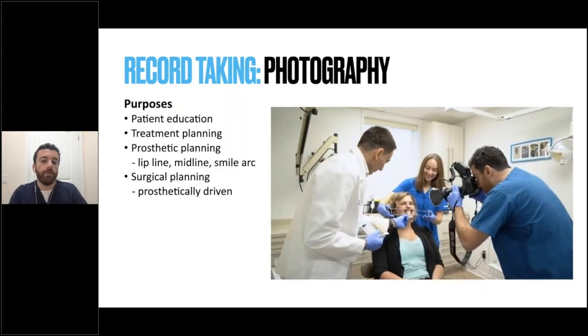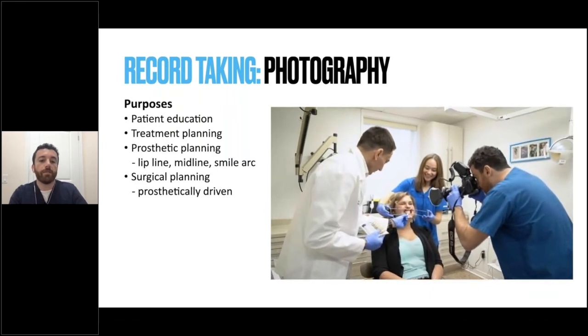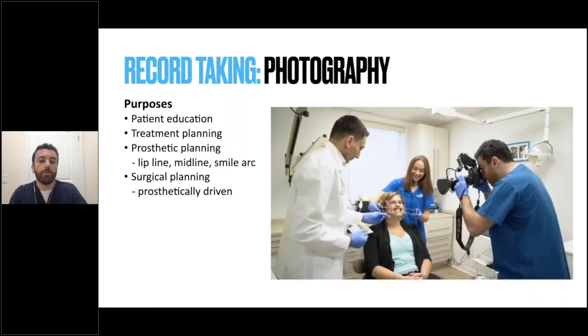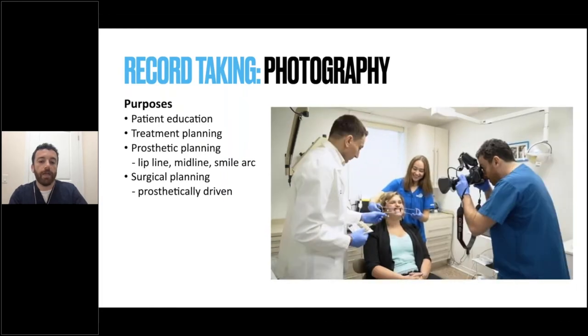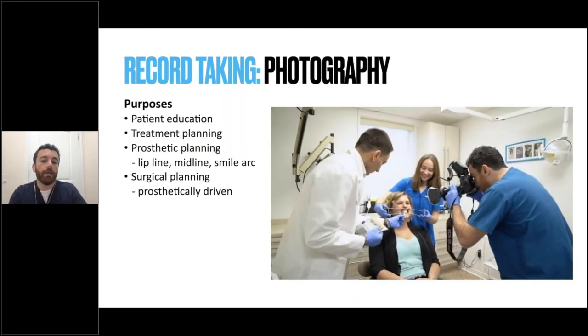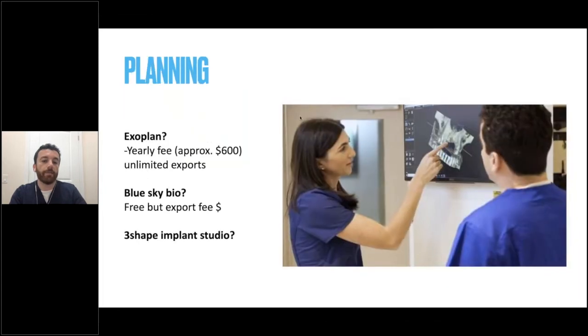Why do we want to do this? A number of reasons. Patient education. You're also going to use these photographs and images in order to treatment plan your cases in terms of your midline, your smile arch, and surgical planning of your cases. As well, for documentation's sake, you can also show the patient how they started and give them an expected outcome with the photos that you have in place.